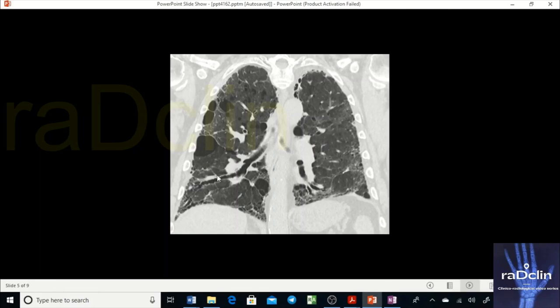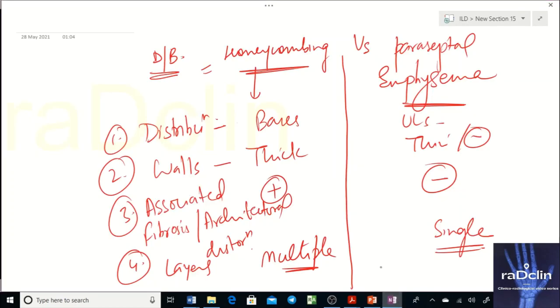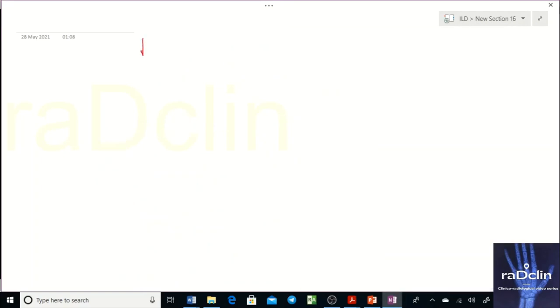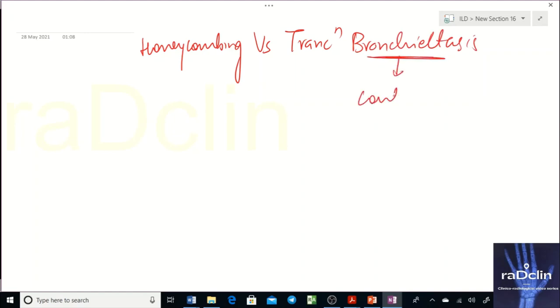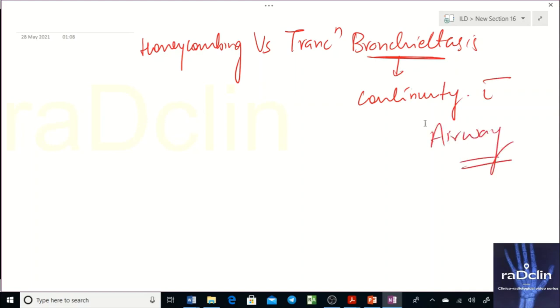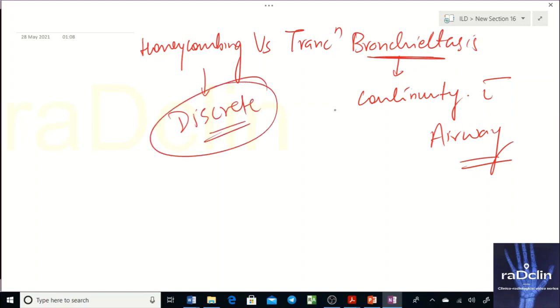Honeycombing can also sometimes be confused with traction bronchiectasis, but that is easy to differentiate: if it's bronchiectasis you will see continuity with the airway, whereas honeycombing consists of discrete cysts with no airway continuity. Scrolling through the CT images helps confirm the distinction.